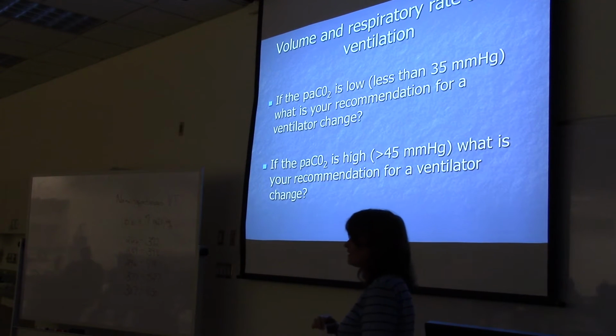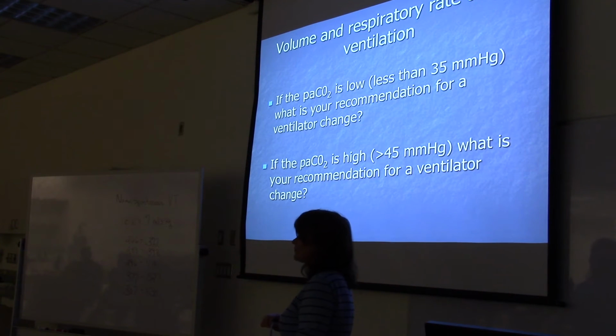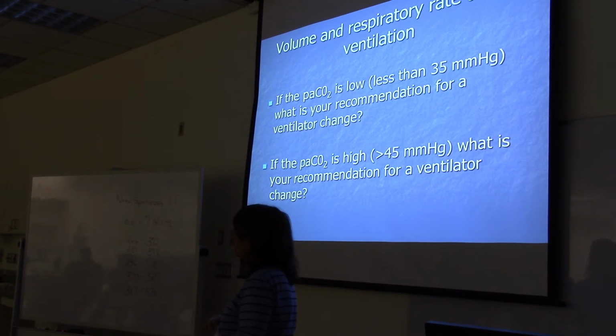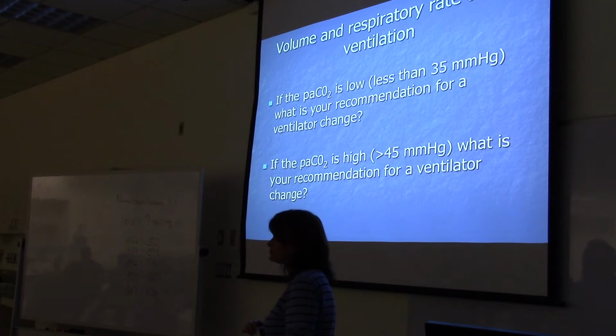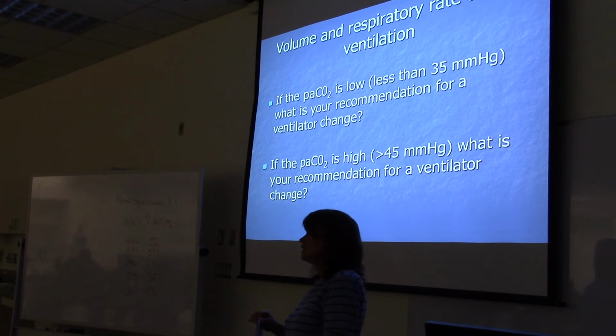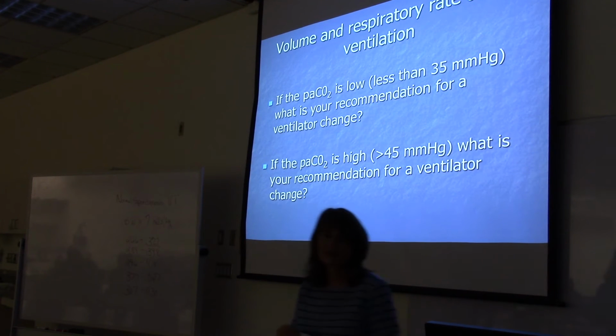What if it's on the lower side of the normal for the tidal volume, 6? You increase it to 7? You could potentially increase it, yeah. Then you have to be monitoring the different loops to see if there's too much compliance or something. You could check the compliance after you've changed the size of the tidal volume, true. But typically you'll look at airway pressures. If you're putting in too much volume, your pressures will go up. Right. About 30.